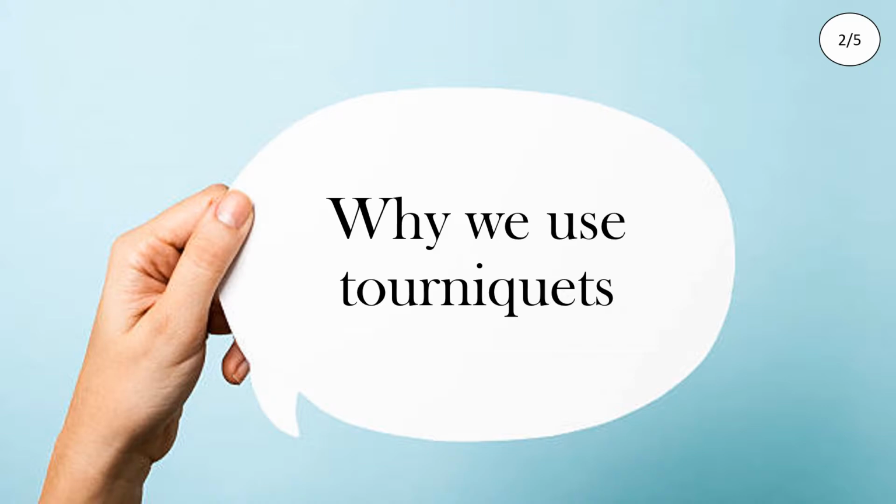When a vein is not easily palpable and seen, you might need to find a more experienced nurse to insert the IV.